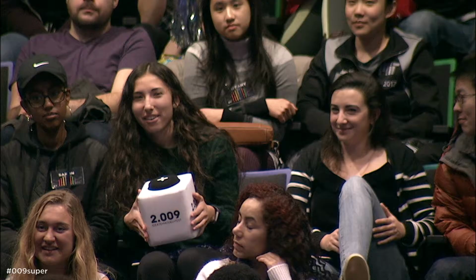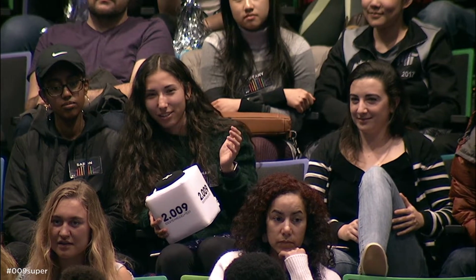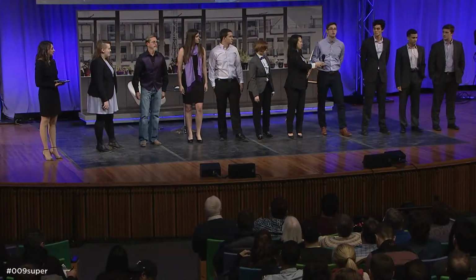Thank you, and I'm going to start right up here with the question. I was wondering if you can wear the watch at all times, or if it's intended for you to take it off after accomplishing a task, and if there are any downsides to having it on all the time? So it only works when you turn it on, and so you can turn it on for a specific task. Obviously, if you wear it all day, it'll drain the battery. So it'll last longer if you turn it off in between tasks when you don't actually need that precise dexterity.